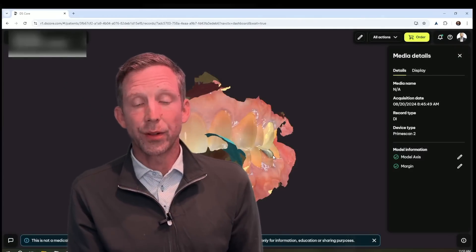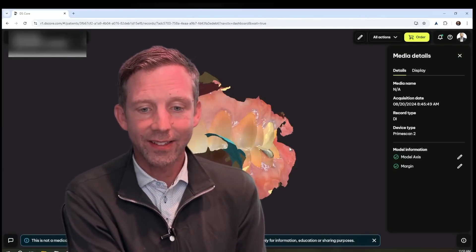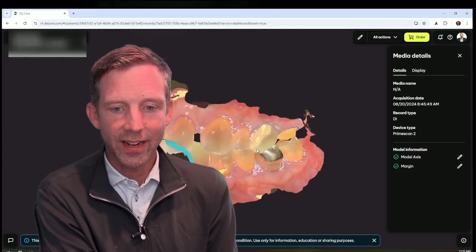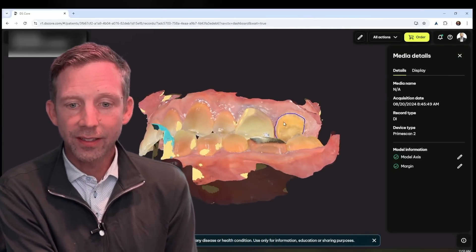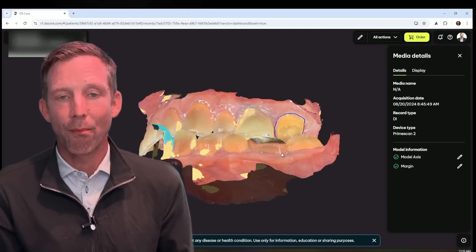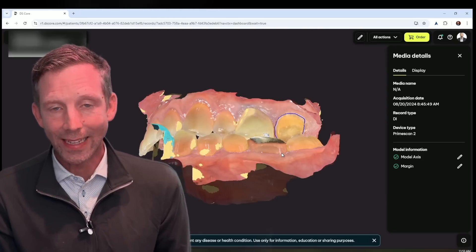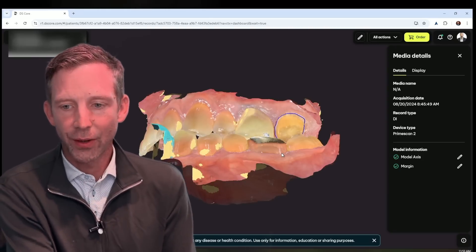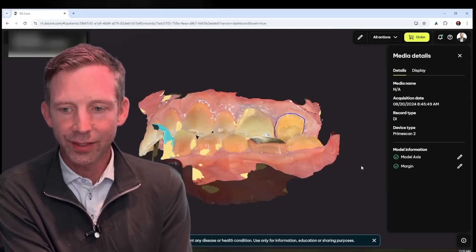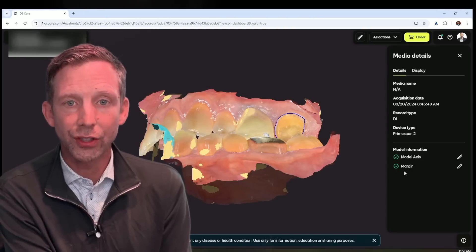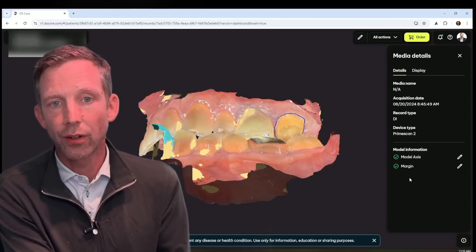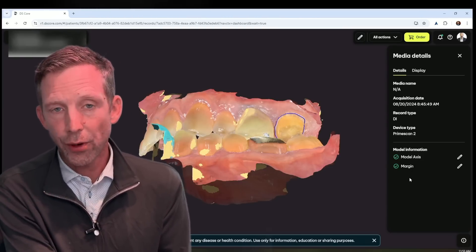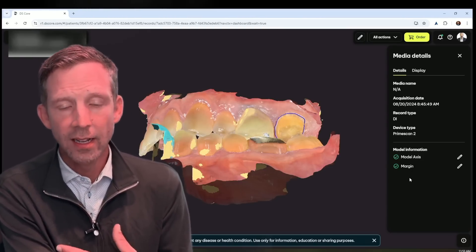So the scan processed within seconds, you'll see it right here. And you'll notice it automatically draws the margin within DS Core. So on the right hand side, you see the model information, model axis, margin. You now can both alter or confirm this directly into DS Core. If you're sending it to a lab, automated margin directly in DS Core.